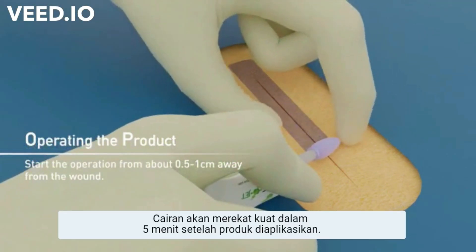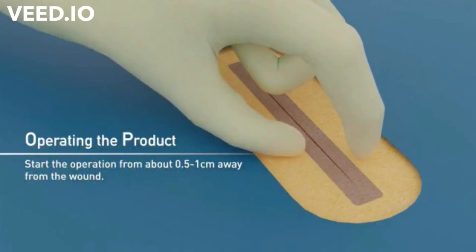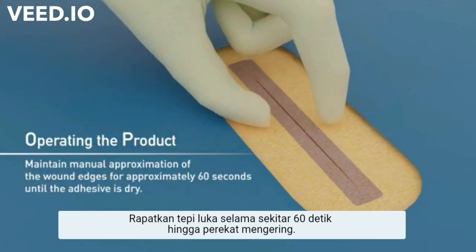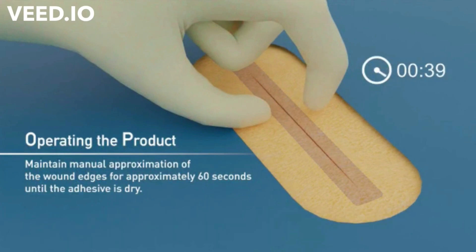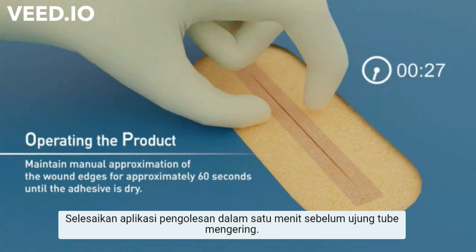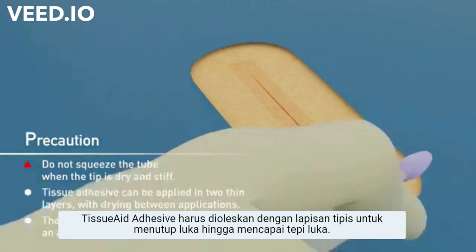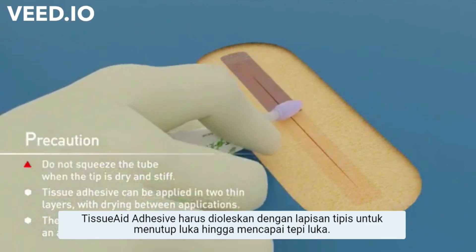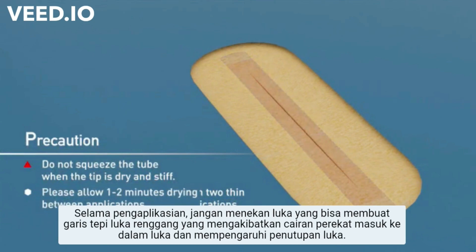Full apposition strength is expected to be achieved within five minutes after the adhesive is applied. Maintain manual approximation of the wound edges for approximately 60 seconds until the adhesive is dry. Try to finish the application within one minute before the soft tip dries up. The tissue adhesive should be applied in a thin layer to close the wound and to reach the edges of the wound. During the operation of the applicator, avoid excessive pressure on the wound, which could separate the aligned wound edges, causing the adhesive to enter the wound and affect wound closure.